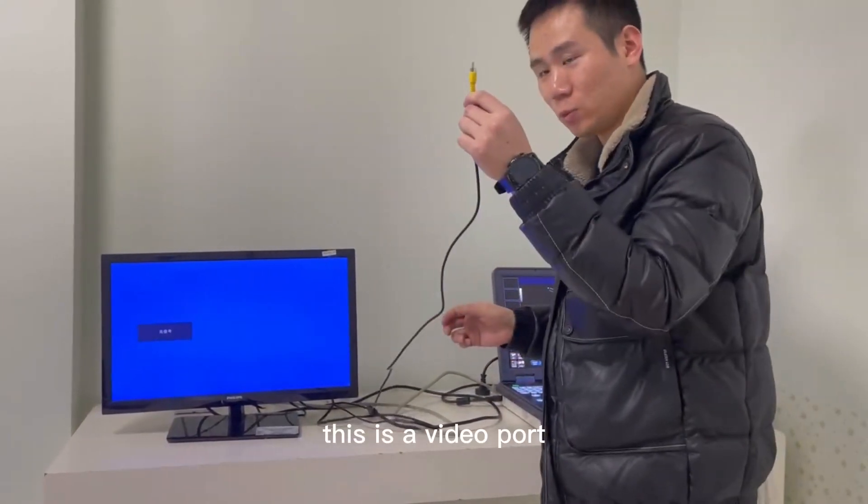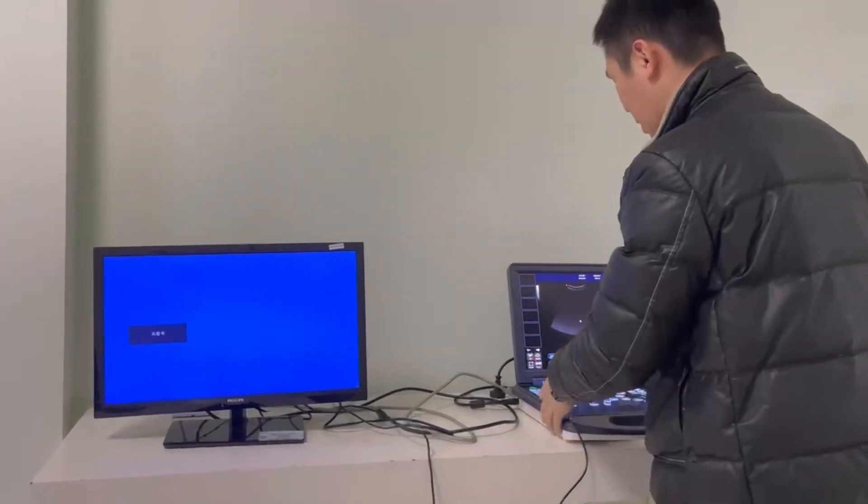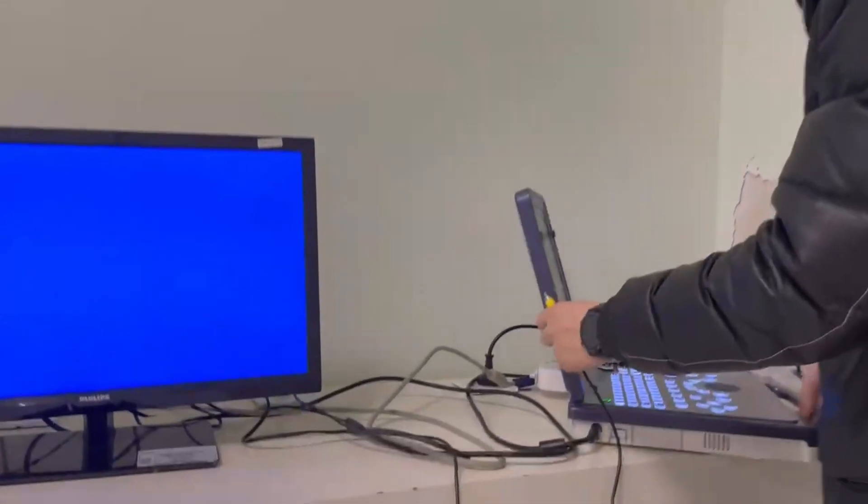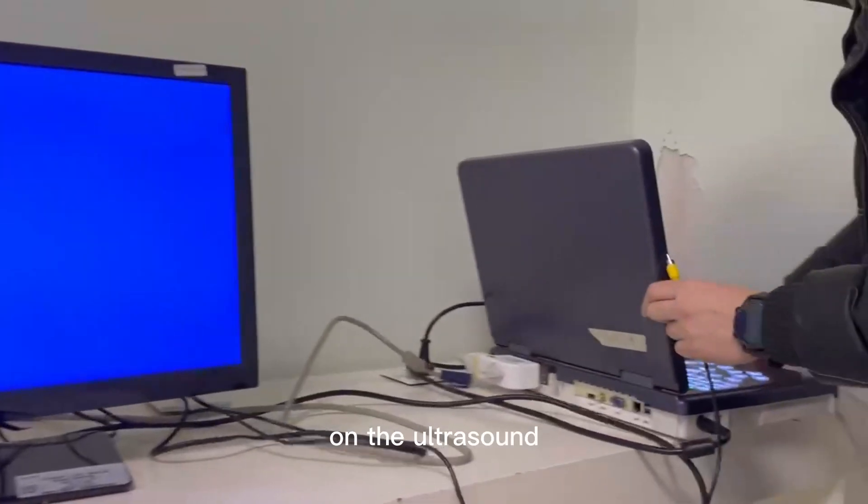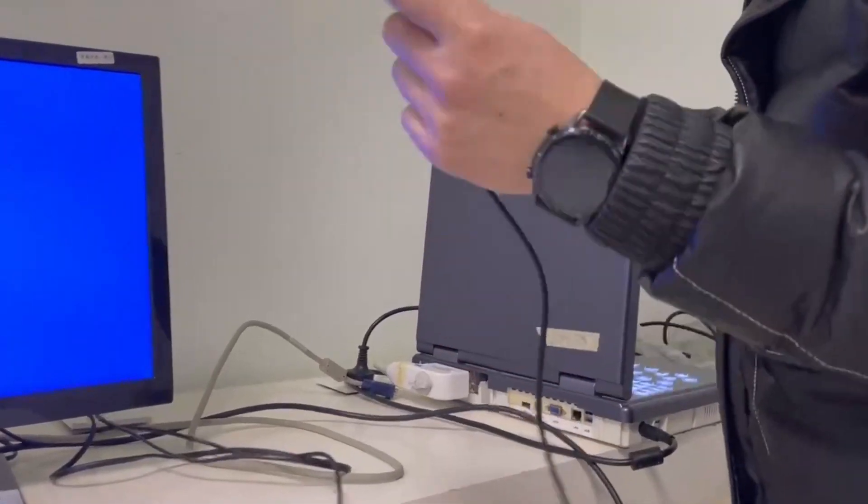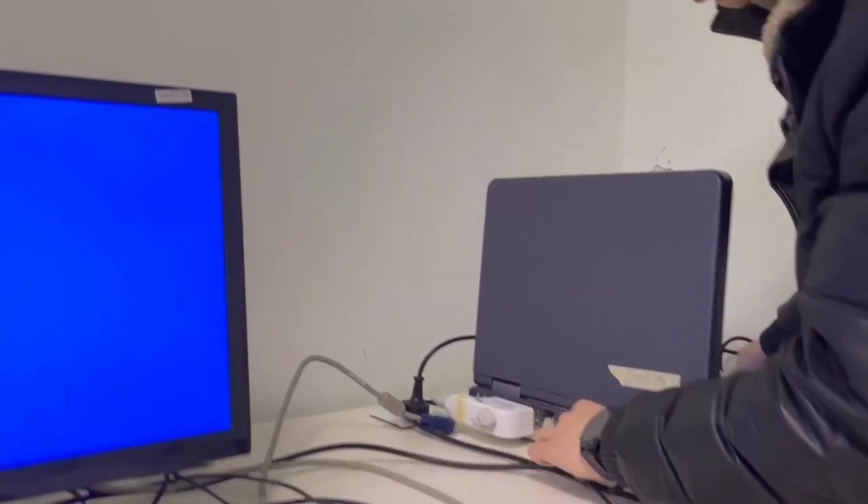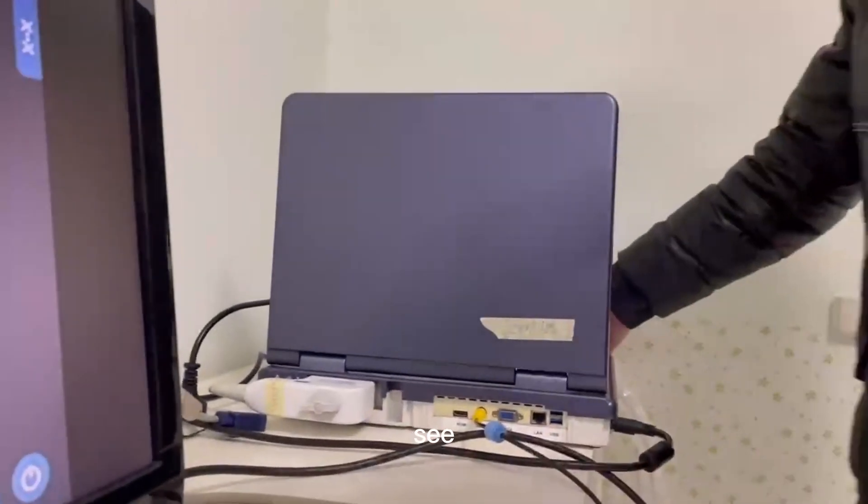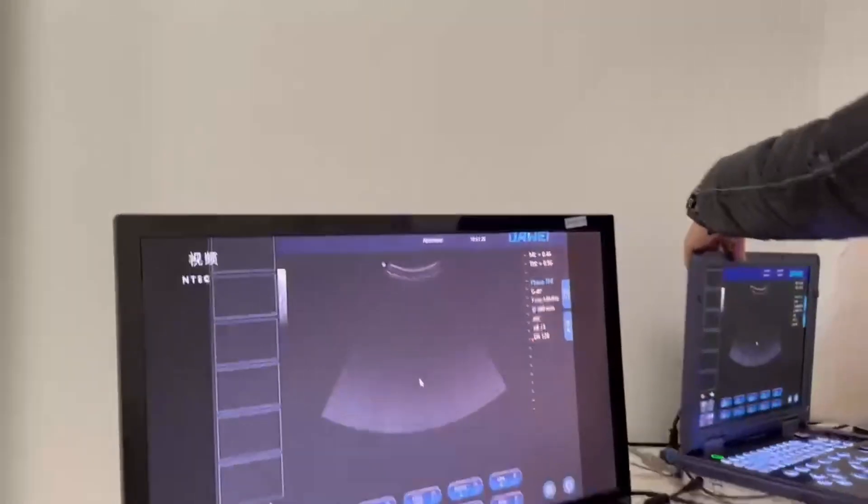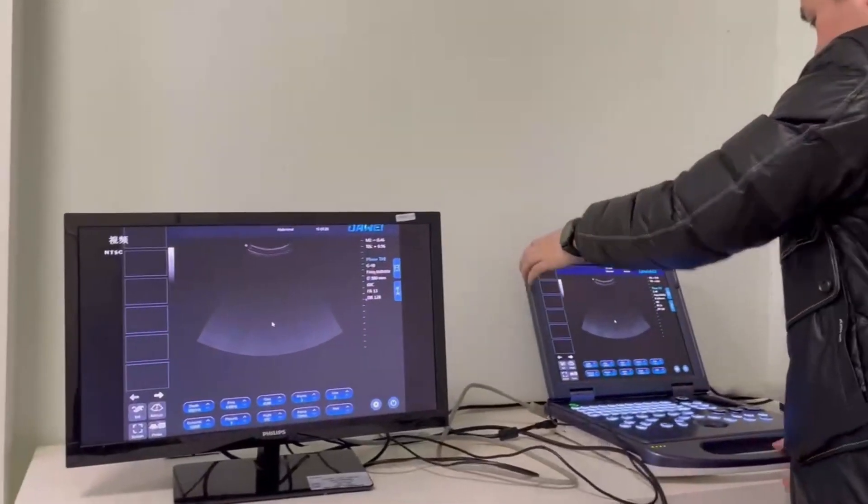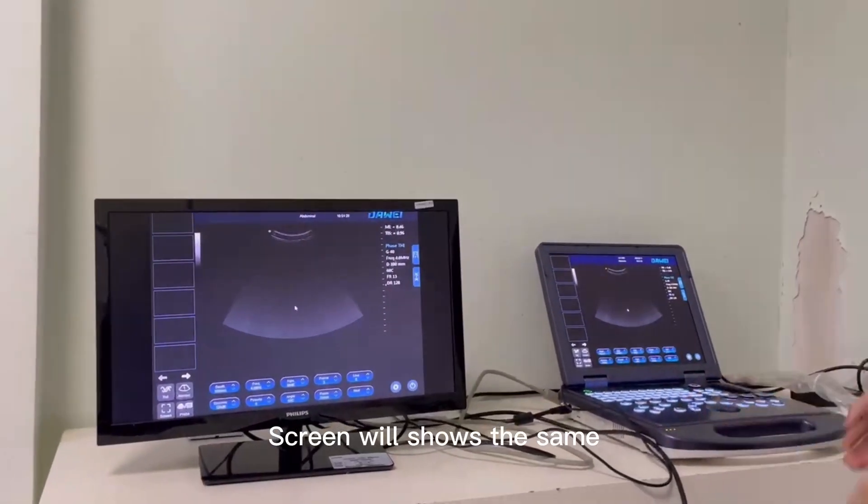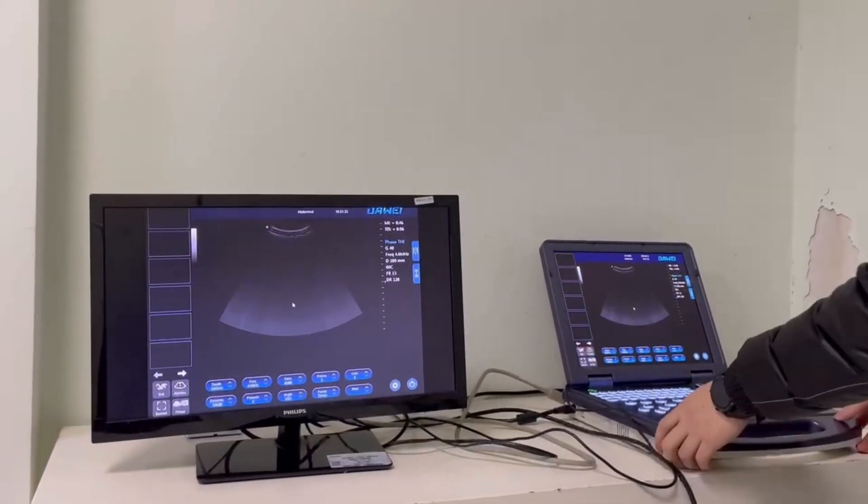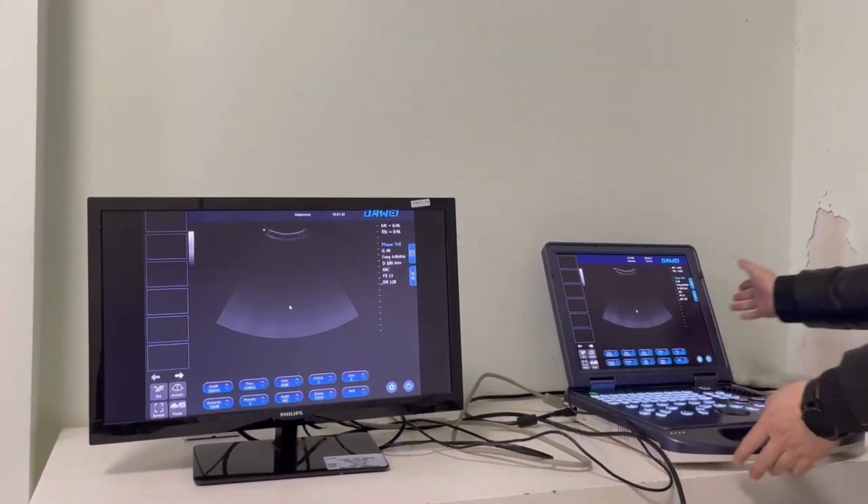This is a video port, and this is also a video port on the ultrasound. Just connect them. See, the screen will show the same image on this machine.